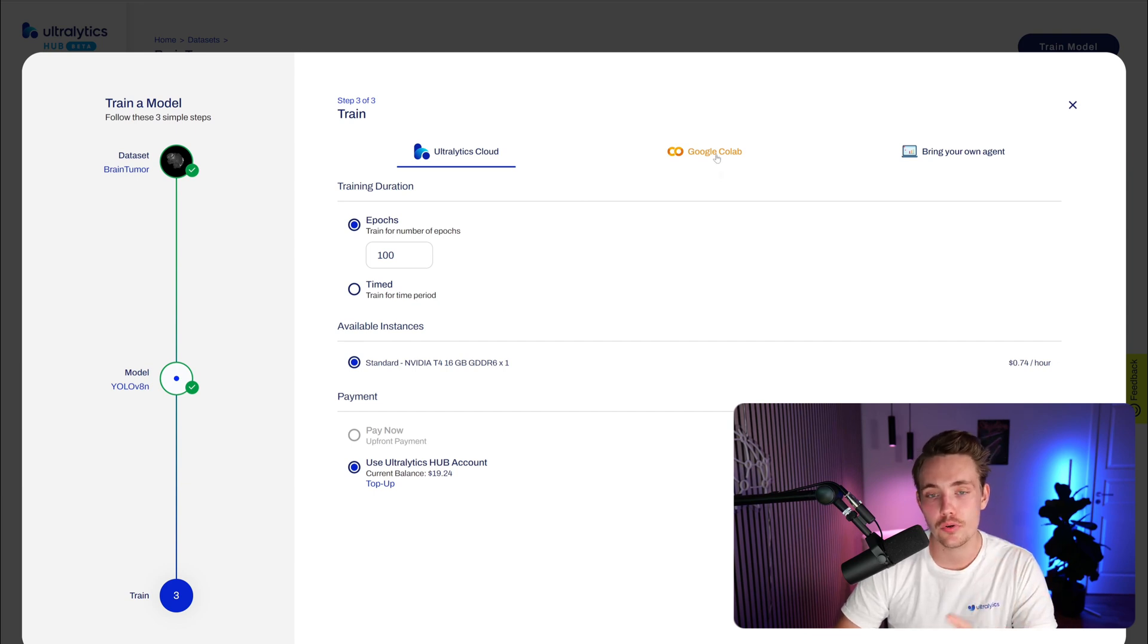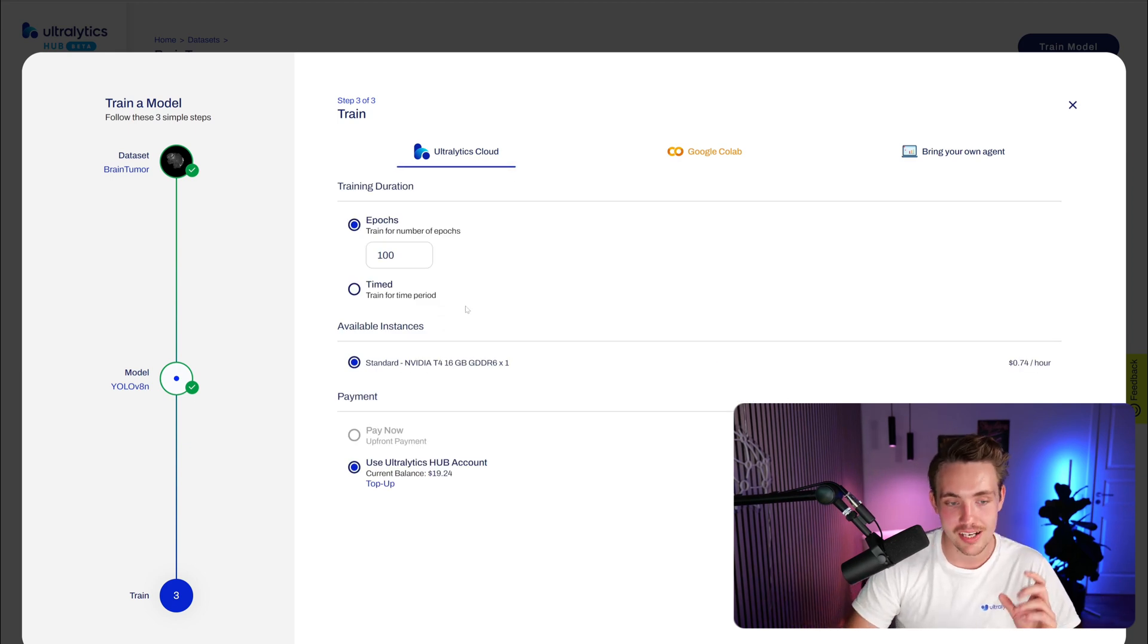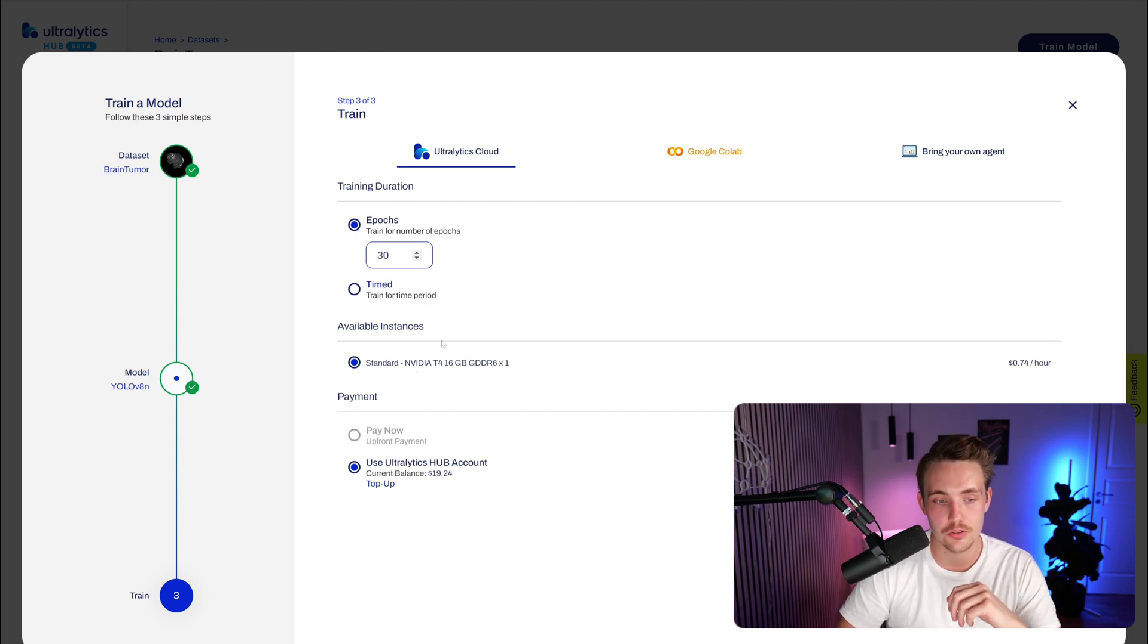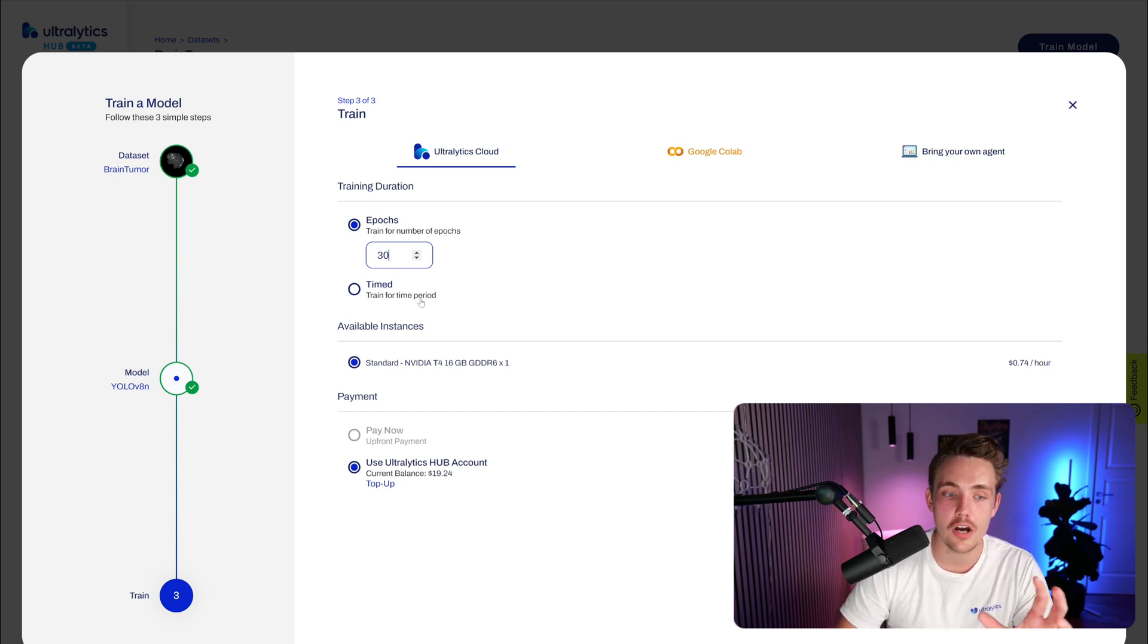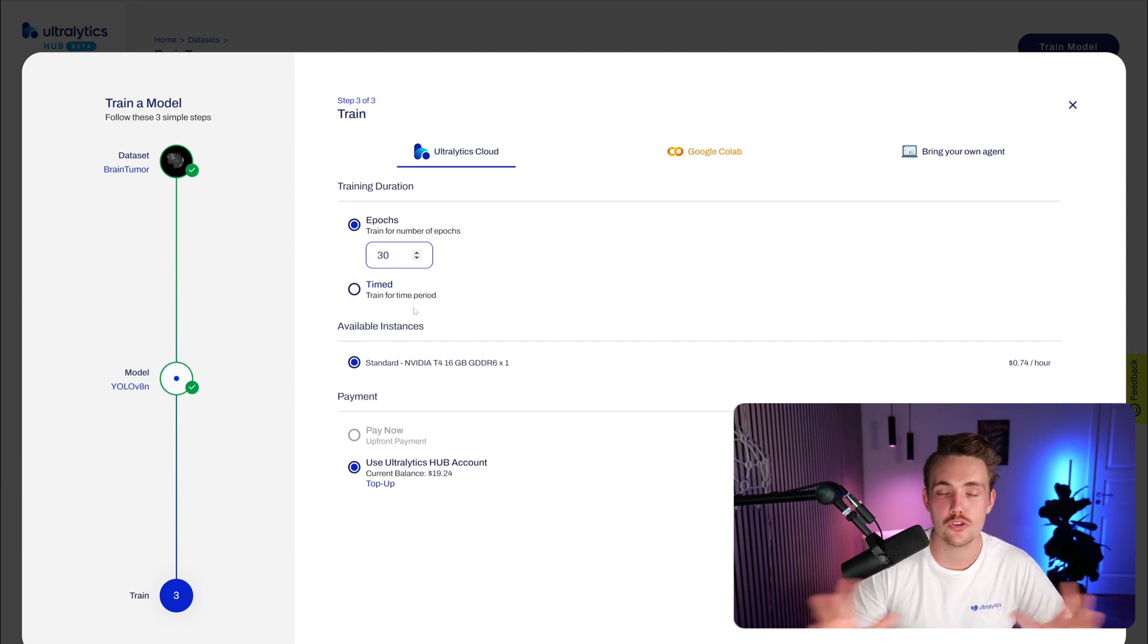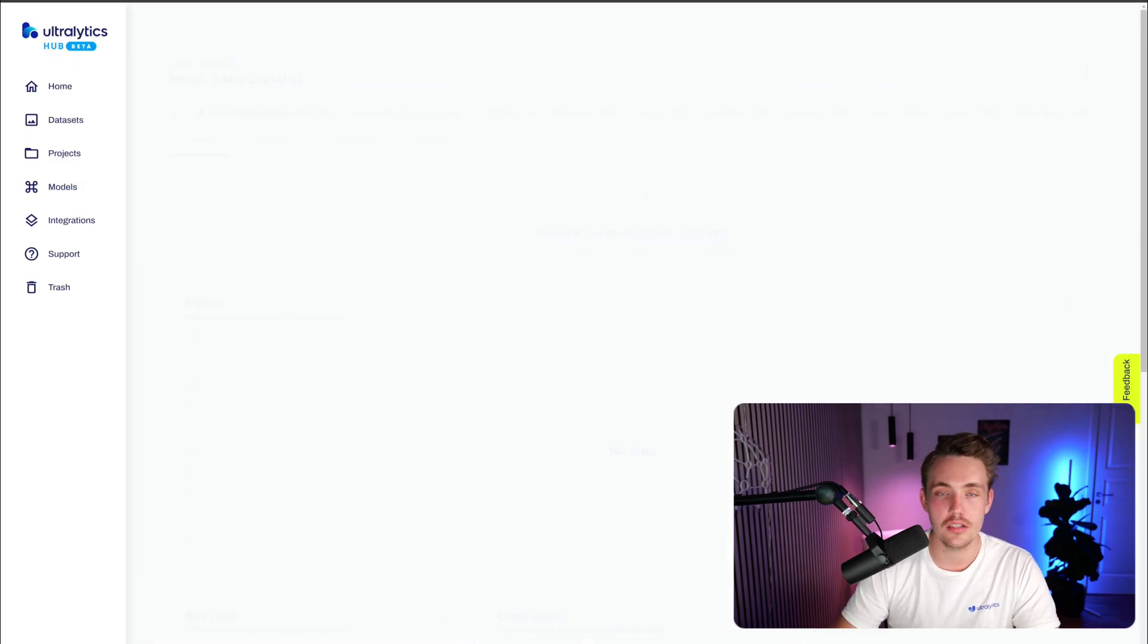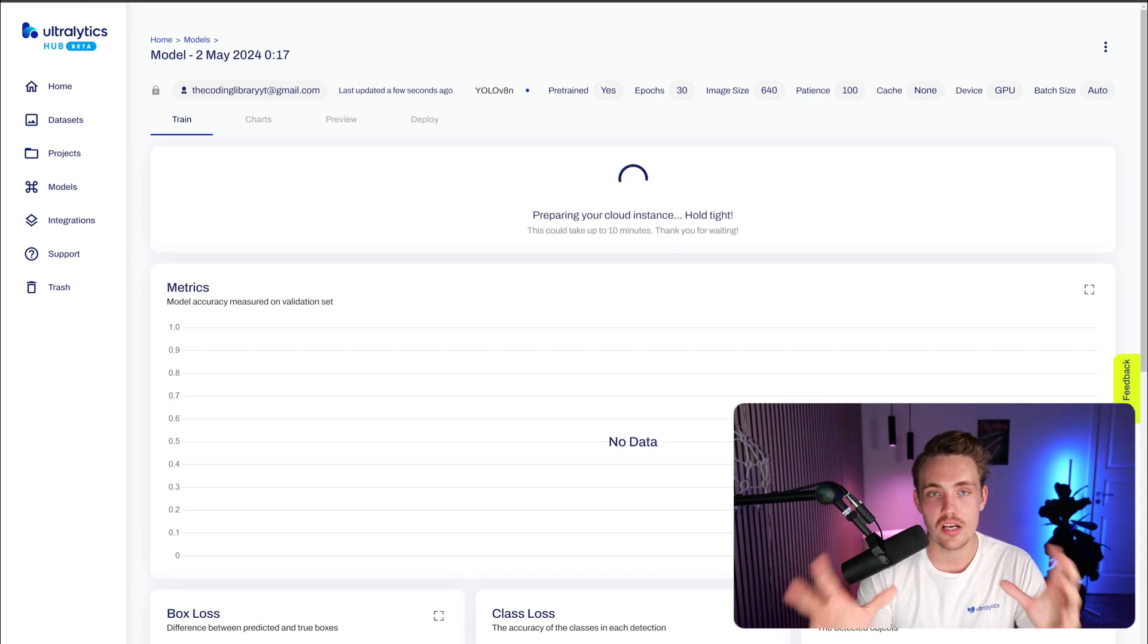We also have Google Colab notebook if you want a few lines of code or bring your own agent. If you want to train locally, you can always upload the models later on. Right now, we just need to specify a number of epochs. Let's just go for 30 epochs. Standard instance that we're going to choose - Nvidia T4, 16 gigabytes of RAM. I'm just going to use the Ultralytics hub account and we can start the training. We also have the option for timed training, basically just train for a certain amount of time, like one hour, two hours, but I like to just specify the number of epochs. Let's go for 30 epochs, start the training. We don't have to do any code. Take dataset, take the model, hit train and we're good to go.